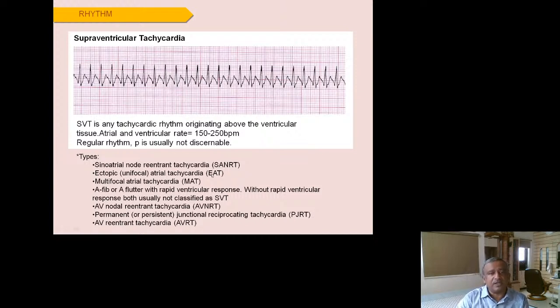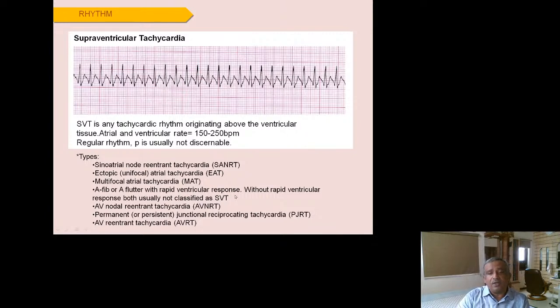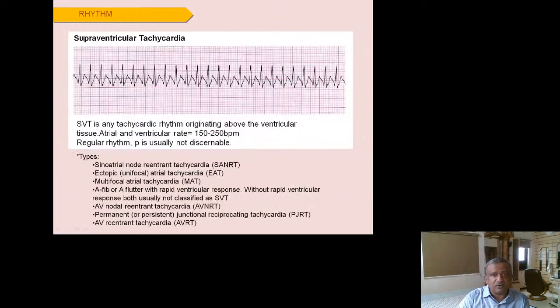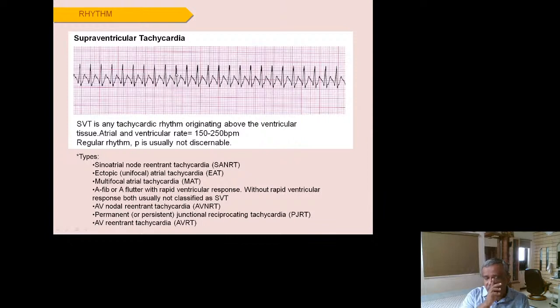Supraventricular tachycardia encompasses any tachycardia originating above the ventricles — including sinus node reentrant tachycardia, ectopic atrial tachycardia, multifocal atrial tachycardia, AF with fast ventricular response, AV nodal reentrant tachycardia, junctional reciprocating tachycardia, and AV reentrant tachycardia. The key distinguishing feature is a narrow QRS complex, contrasting with the broad QRS of ventricular tachycardia. The P wave is often not visible, rate is 150–250, and the patient may remain hemodynamically stable.